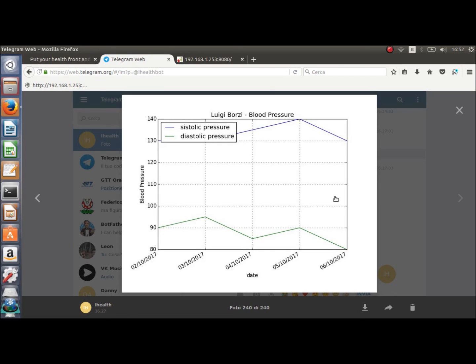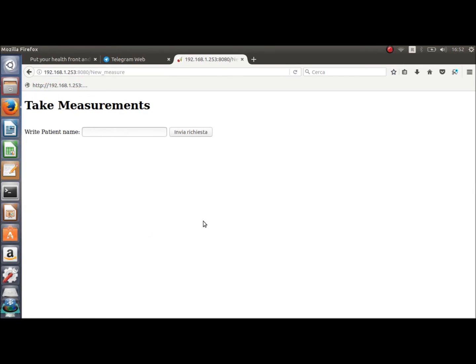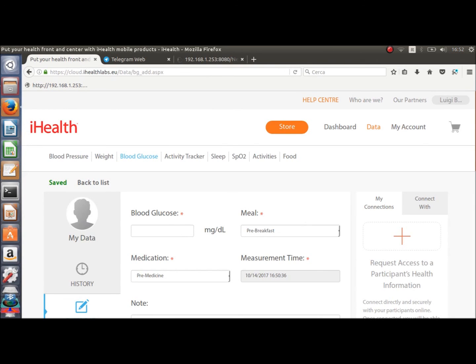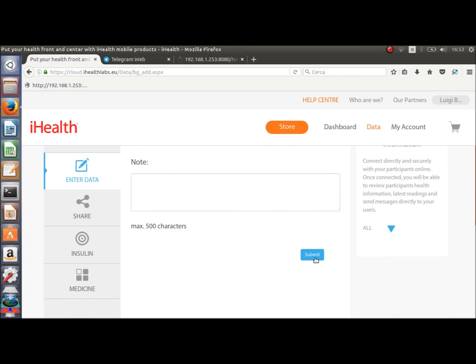We can now have a look at the clinical mode for using the program by clicking on Take Measures, writing down the patient name, and submitting it. The program will open, this time also, 5 terminals with our 5 microservices running in them, and the program is aware of the patient name, so we can send a measurement using whatever account we want, because the program doesn't care about the user ID but just about the name we wrote down. So let's do it.